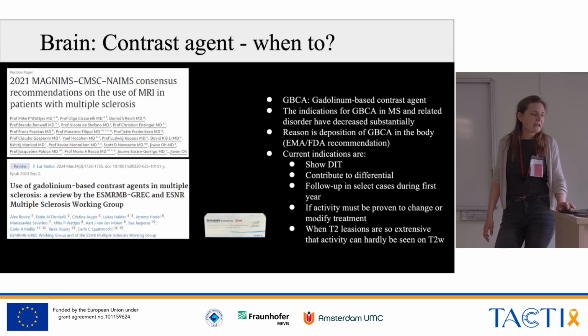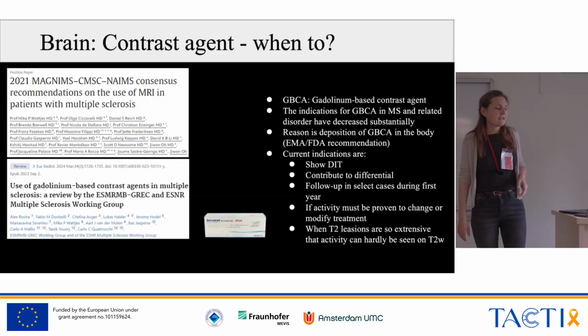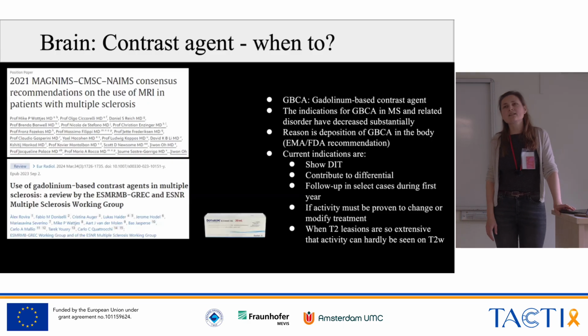But the number of people using CE labeled products, because they have to be CE labeled, so they have to be allowed for medical clinical use, is very low. And so I think the prices are pretty costly. Of course, in an experimental setup without CE labeling, there's a lot more use of that, but in the clinical context, only very few centers use this. So currently solutions are missing.